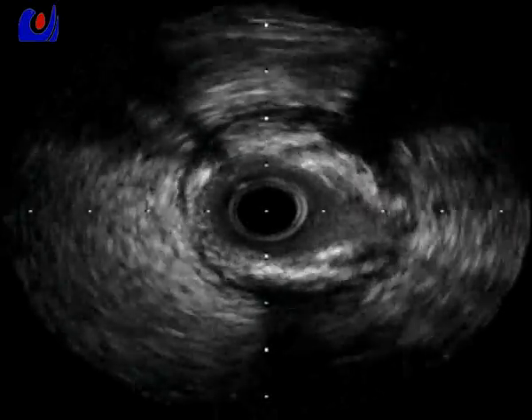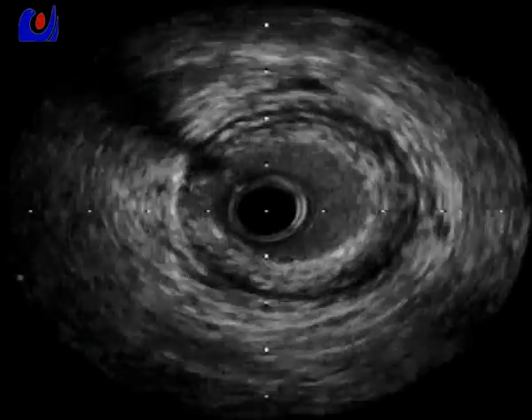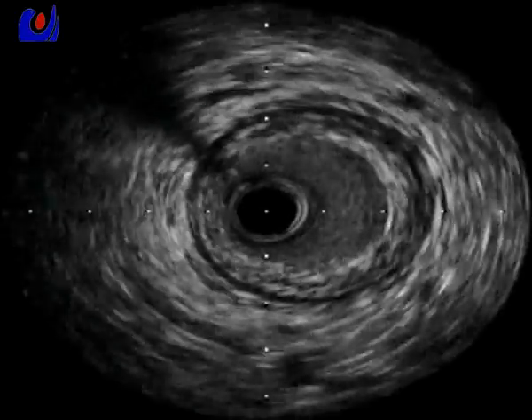Okay, so proximal is at least 3.0 compatible. Maybe the mid to distal can get up to 3.5 to 4.